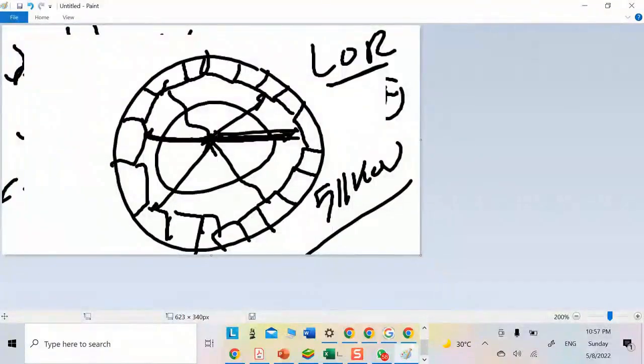In this context, the decay time is very short. If it were long, it would delay the process or reduce the effectiveness of the crystal. You need this electron decay time to be very small so that you can start taking the next photon and the subsequent ones. The third property is that you can stop the photon.